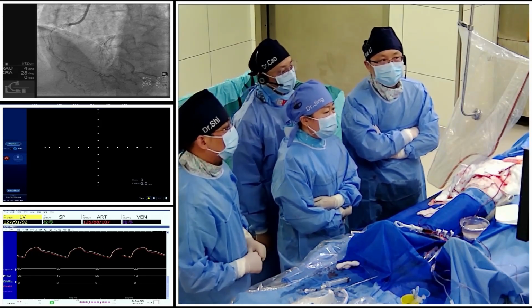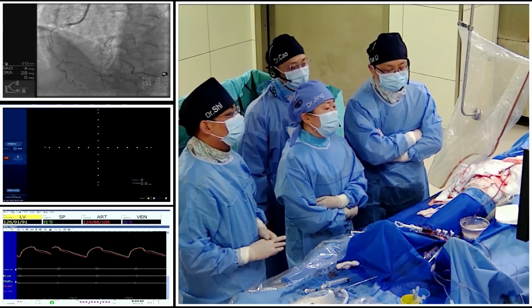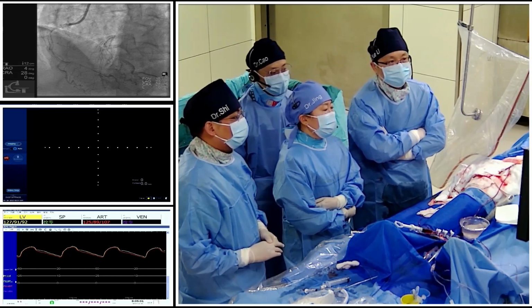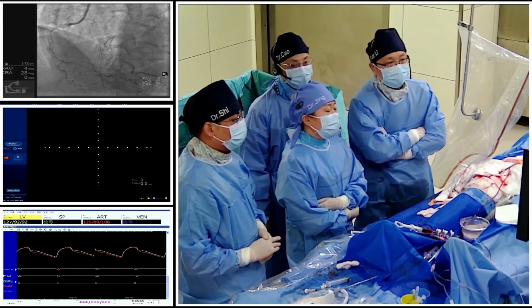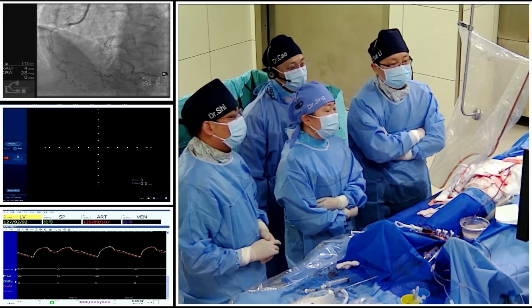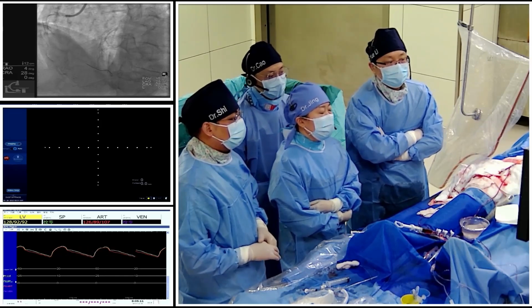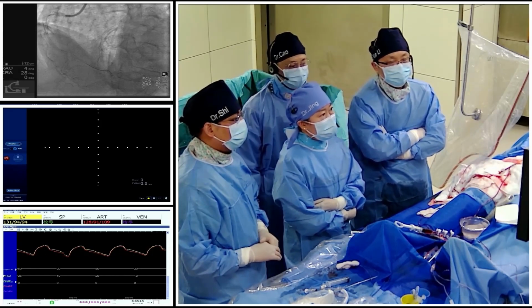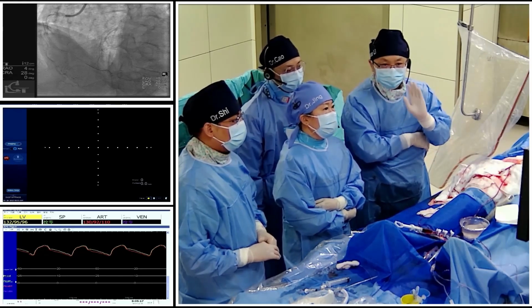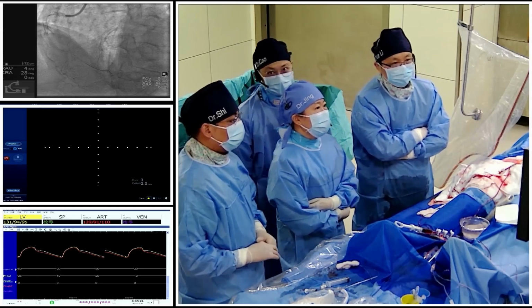I am privileged to be the moderator of the current operation through MedStream 360 to demonstrate our theory and techniques in our daily PCI work. I hope each and every one of you will enjoy the following unique CTO case. Please allow me to introduce the leading first operator of today's case, Professor Li, who is the leader of our hospital. Okay, next, let's begin our case.